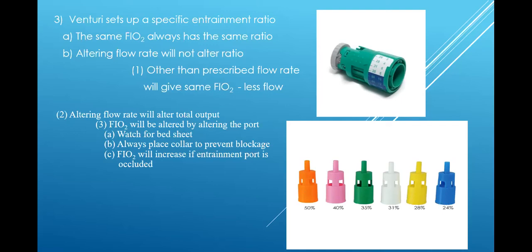Okay, this is where you put somebody who needs a high flow system, right? They're not breathing consistently. They're breathing either shallow or kind of fast, anxious, right? Breathing 25, 26, 27 breaths per minute. Let's just go and put them on a Venturi to make sure we're good, okay?